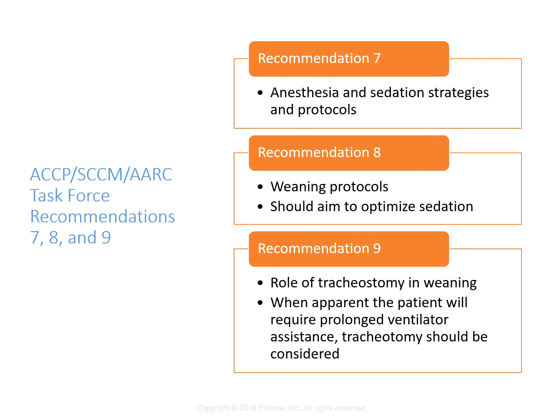Now, can you imagine having something stuck in your throat and then having a very light level of sedation and not knowing what's going on? And when we're looking at protocols for ventilator discontinuation, they're usually designed for non-physician clinicians, the respiratory therapist, the nursing staff, right? And usually they're implemented by us, the ICU staff. So they're aimed at optimizing sedation, and these are what you look at for therapist or nurse-driven protocols here.